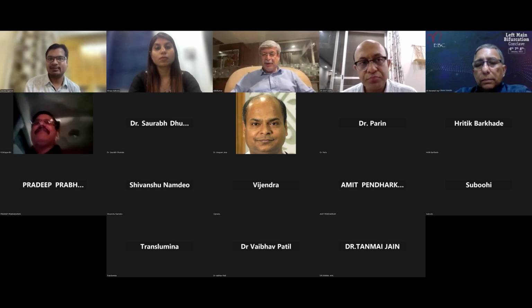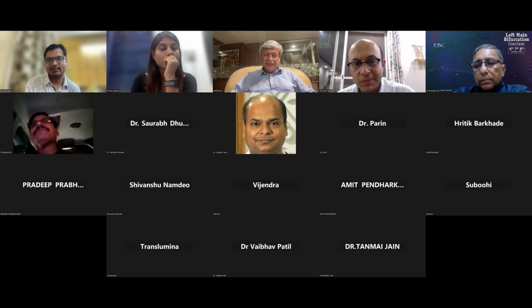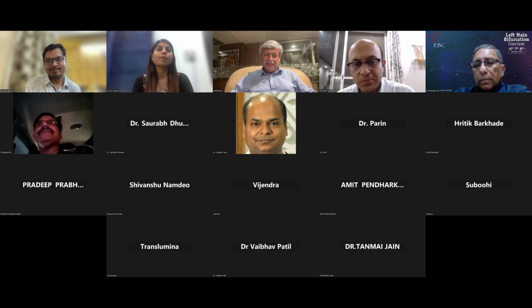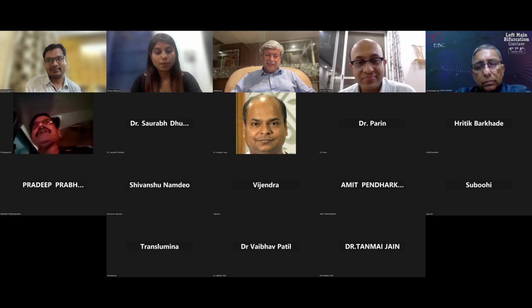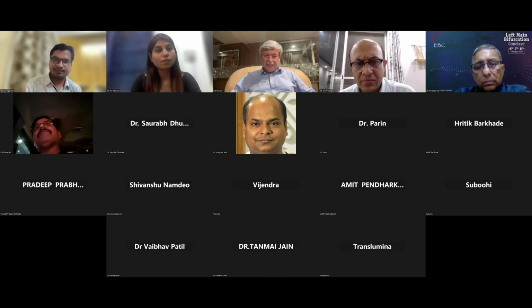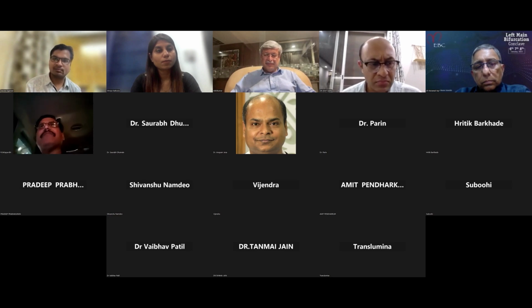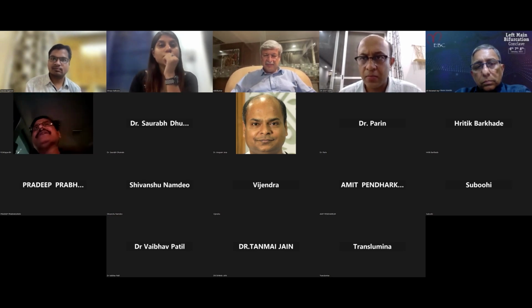Yes. Anyway, very nicely and patiently, you managed and bailed out the complication, Dr. Gaurav. And most important, the lesson of the case is don't use hydrophilic polymeric jacket wires. This is a fundamental thing. Whether the polymeric jacket wires like Fielder series or Whisper or Pilot, all these are basically hydrophilic polymeric jacket wires.